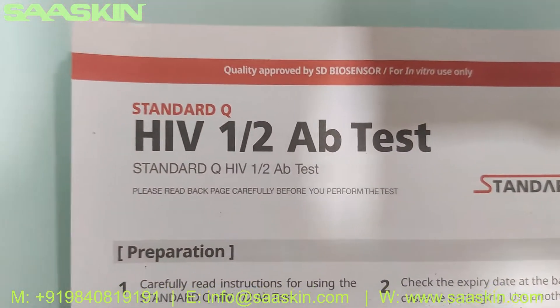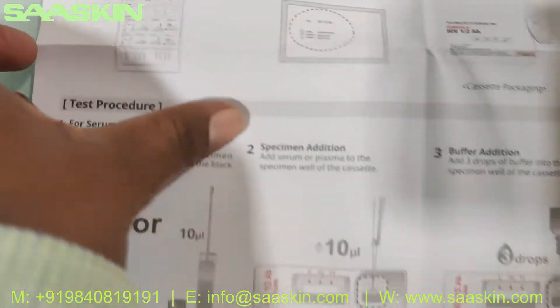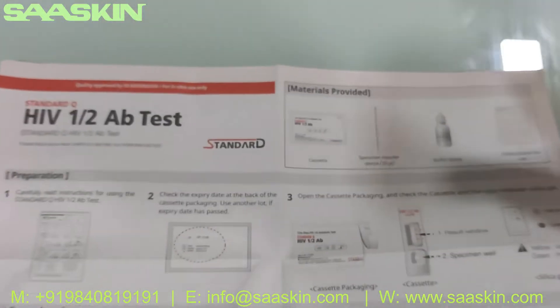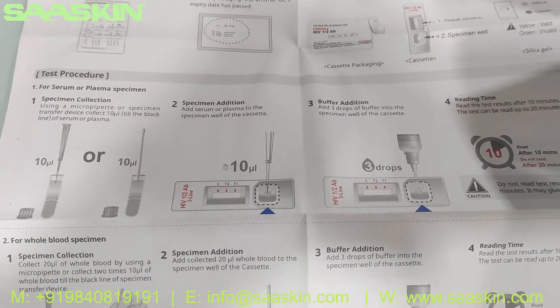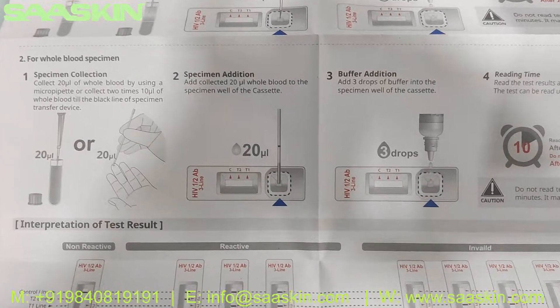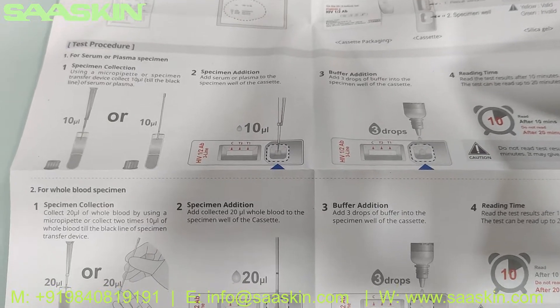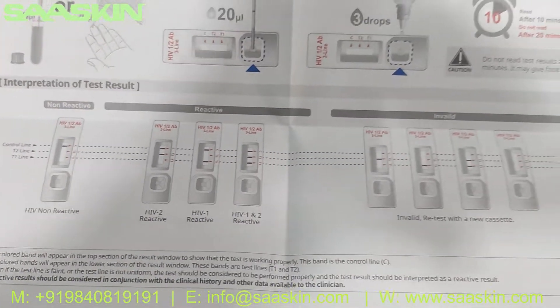You can see here it says Standard Q HIV 1 and HIV 2 antibody test kit. The IFU brochure — let me show you the brochure — it talks about the preparation and test procedure, and you can also interpret the results. The complete instruction is here, from the test preparation and how to conduct the test, for serum, plasma, or whole blood, and how to interpret the results.